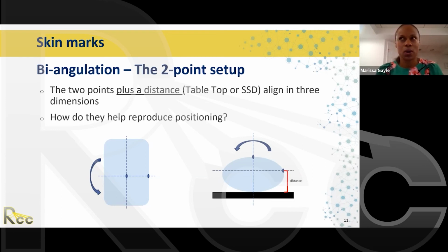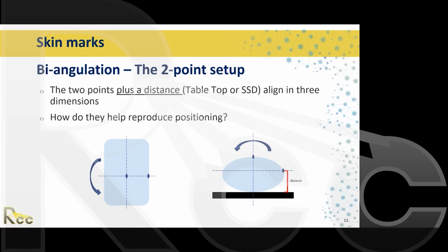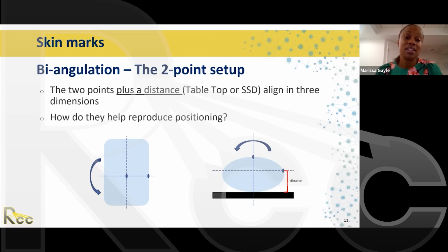There was another part to that question. How do you enforce compliance during treatment? Well, we enforce compliance because we do a CBCT daily on many of our prostate patients. So looking at the CBCT, we will see if the rectum is full or not. And if it's full, then we take them off the table, because if the rectum is too full, they may be pushing the prostate out of the field.